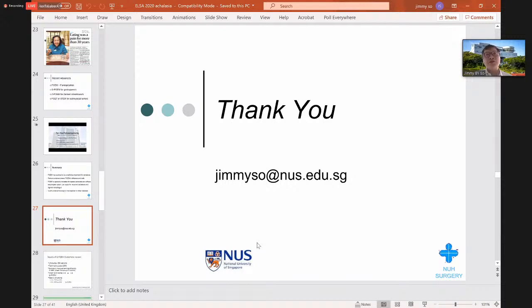Early in our series, we usually performed a trial of either Botox or balloon dilatation of the pylorus, just to make sure this was really a case of pyloric spasm. But nowadays, many centers will offer gastric POEM once they confirm gastroparesis by endoscopy and gastric emptying scan. Therefore, it's important to recognize that there is a confirmed gastroparesis. Then these cases are suitable for gastric POEM.